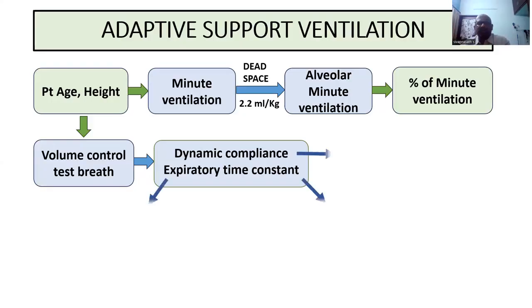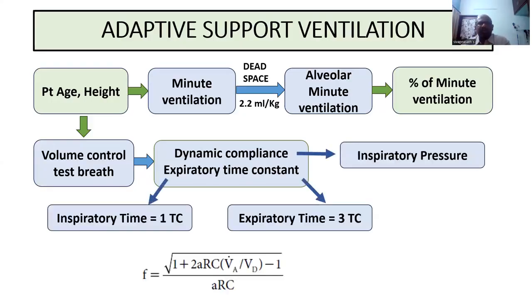With this, what it will do is, it will take three parameters. First is, it will calculate the inspiratory time. Inspiratory time will be no less than one time constant. Expiratory time will be at least three time constants. That is why I told you, if you go to the previous videos, you will understand this better.